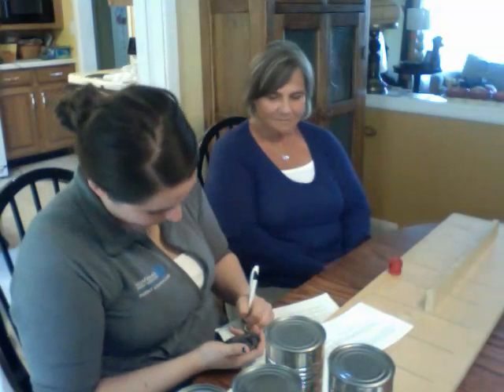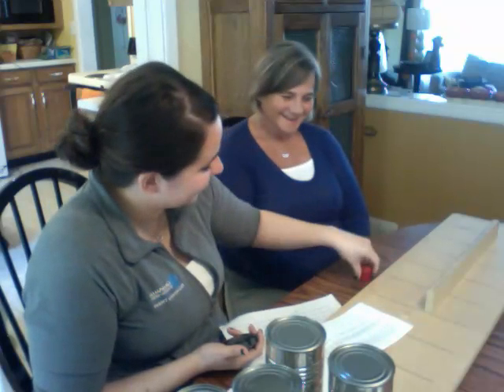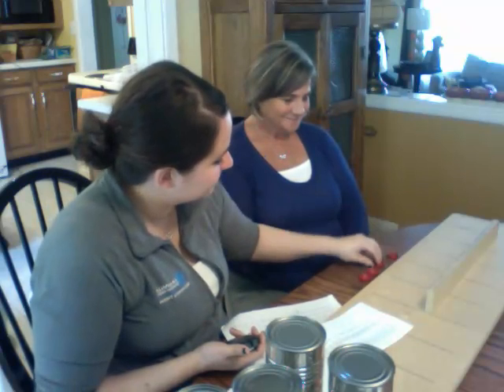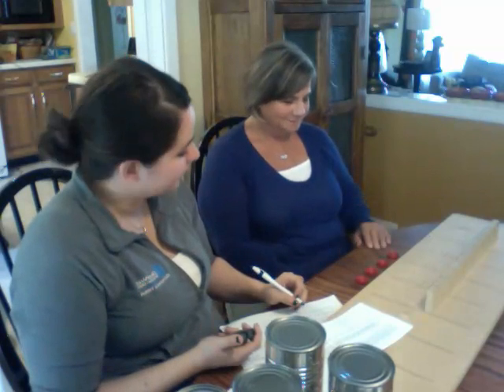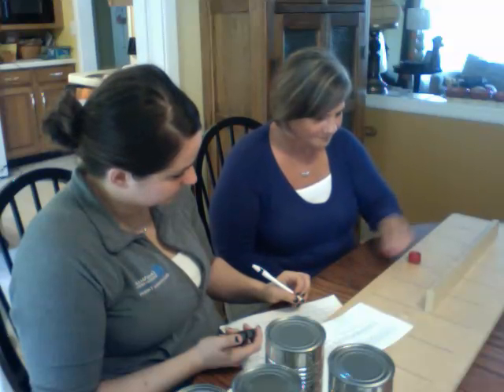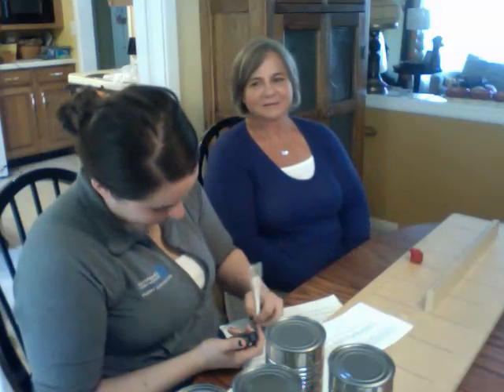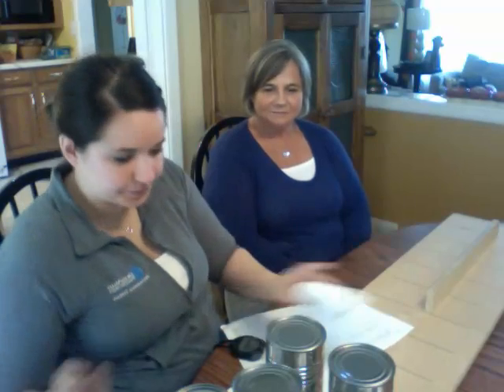Very good. That was a good time, Mom. Was it? Yeah. All right, now we're going to do it with your non-dominant hand. I mean, your dominant hand. Okay. See? All right. Trying to confuse you, but you did a good job. All right, the same thing with your right hand. All right. Are you ready? Yes. All right, go. Very good. All right, and we're almost done. You're doing a very good job.